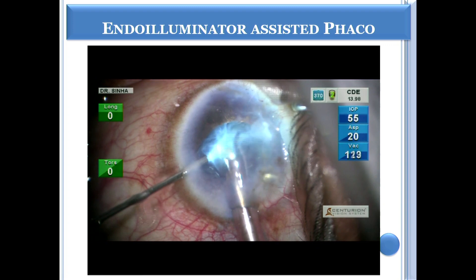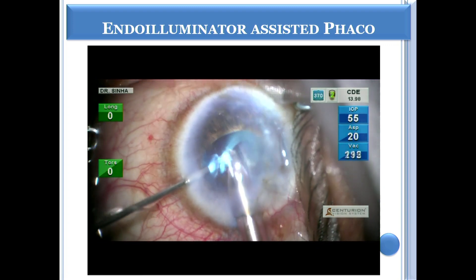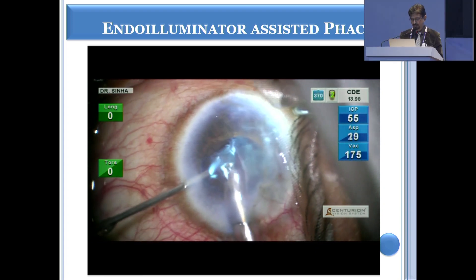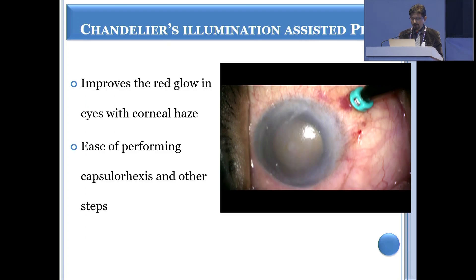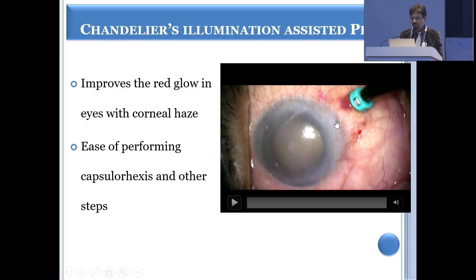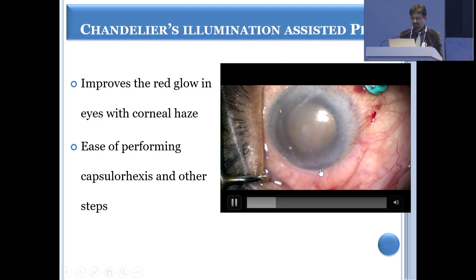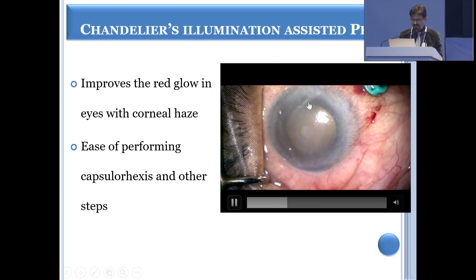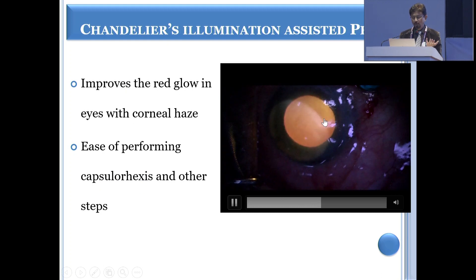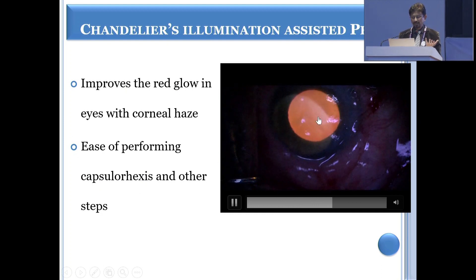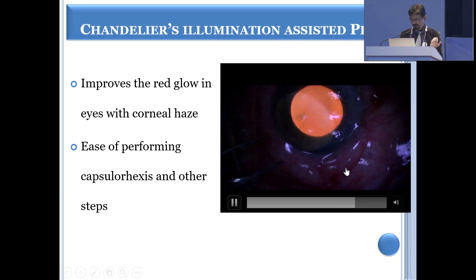This is how you can see how well the endo-illuminator is helping. You can also use chandelier illumination from the pars plana, and in a case of a slightly hazy cornea, it improves the glow. Once you get a red glow, you can do a rhexis and complete the procedure.